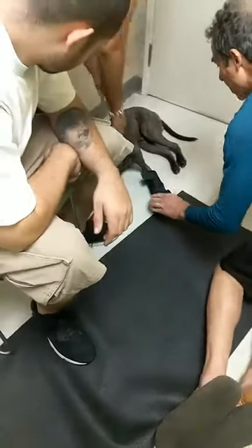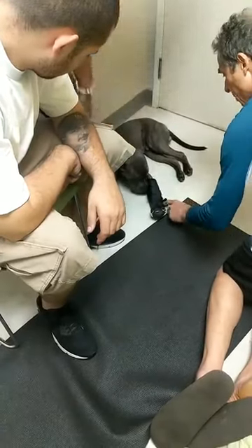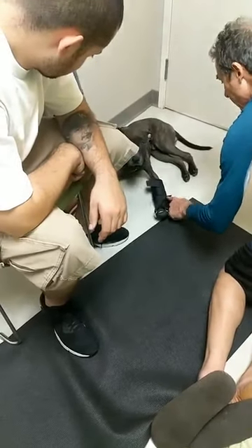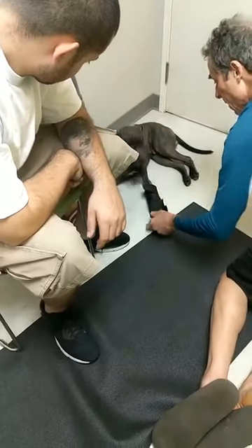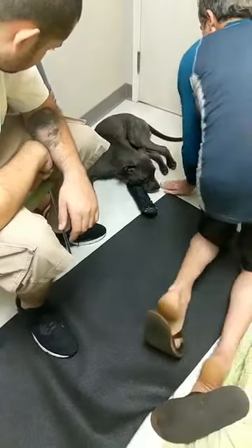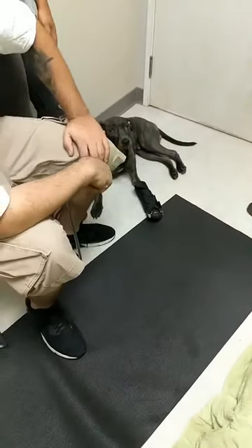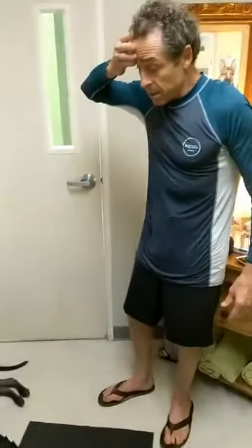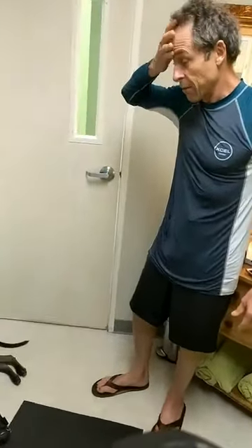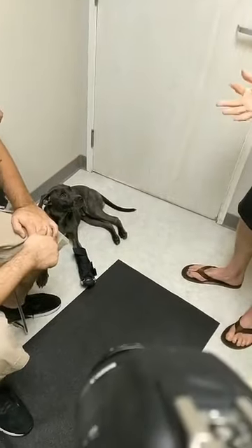So this is a way better fit — a little better. Just trim those tabs off. They say to start out for a few minutes at a time. I would do like five minutes, three or four times a day if you can. That'll get him used to getting in and out of it, and you used to putting it on fast.